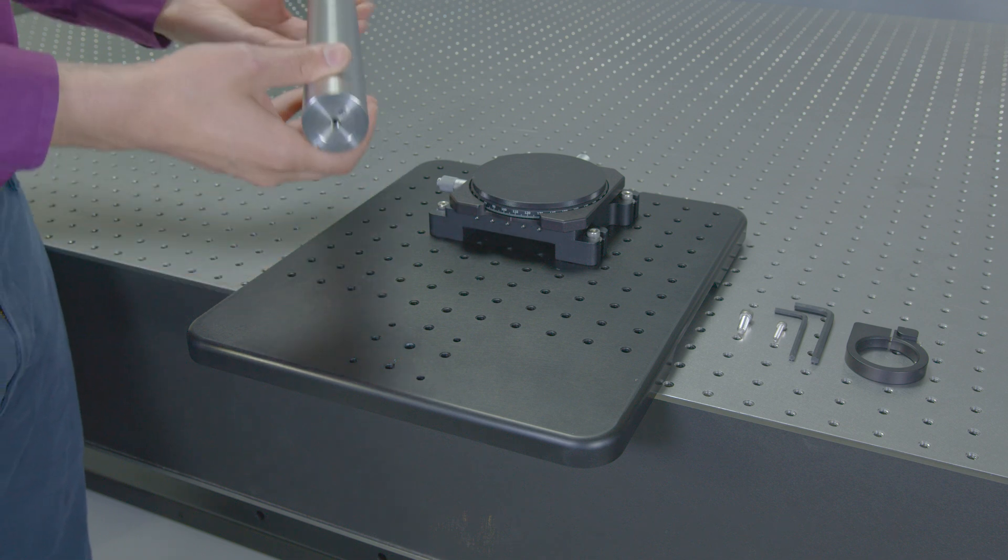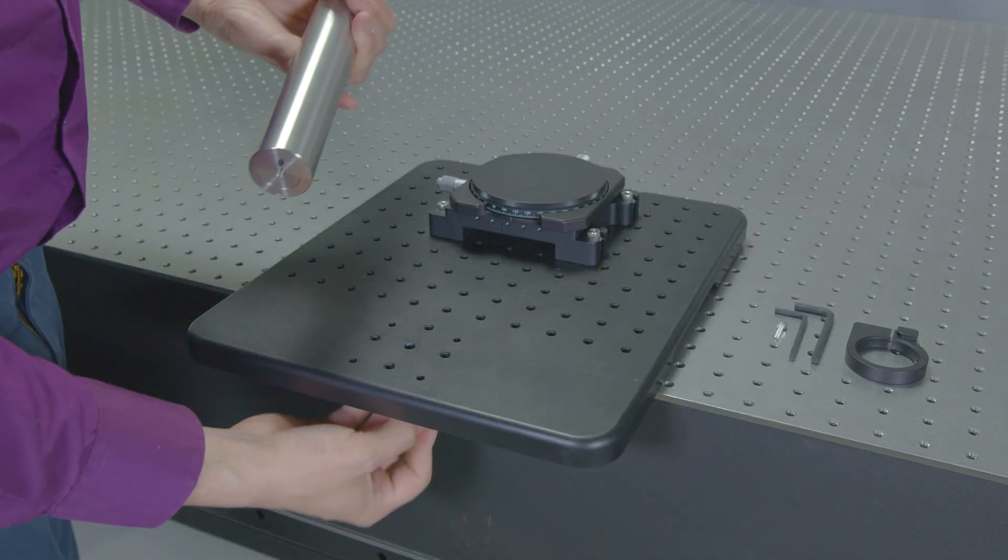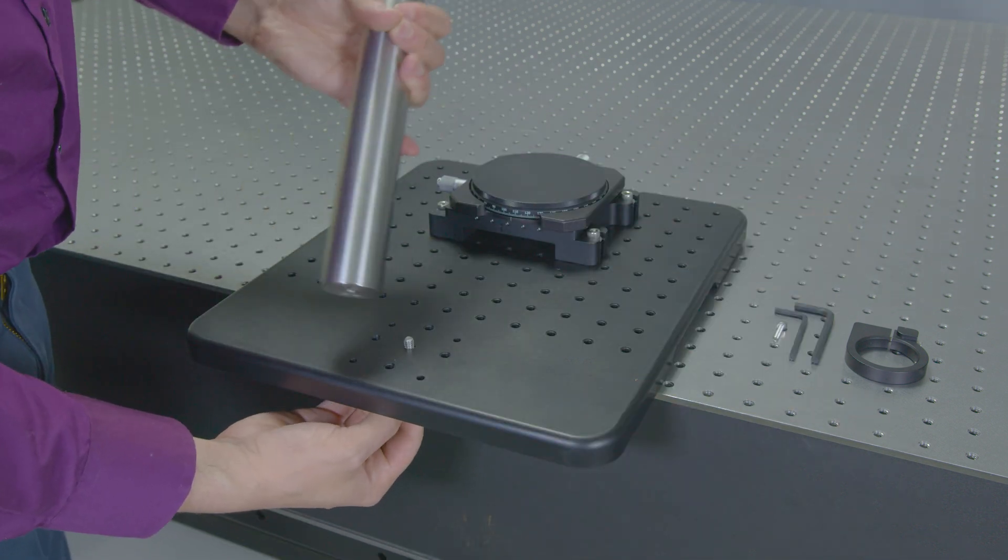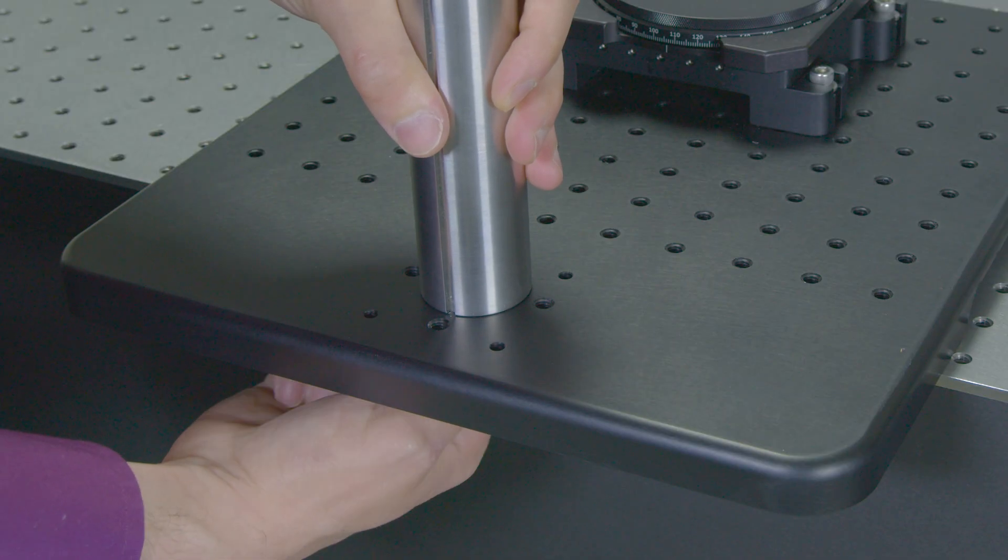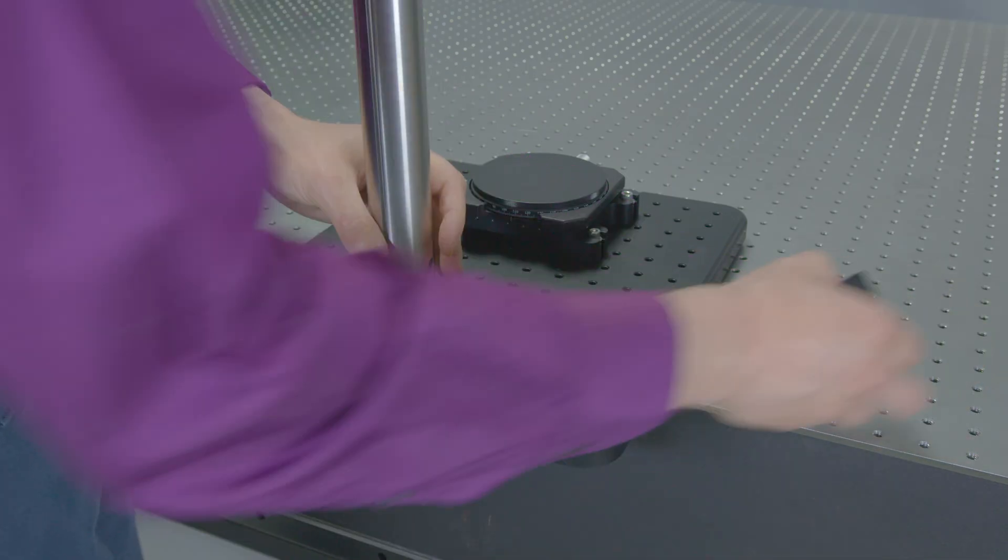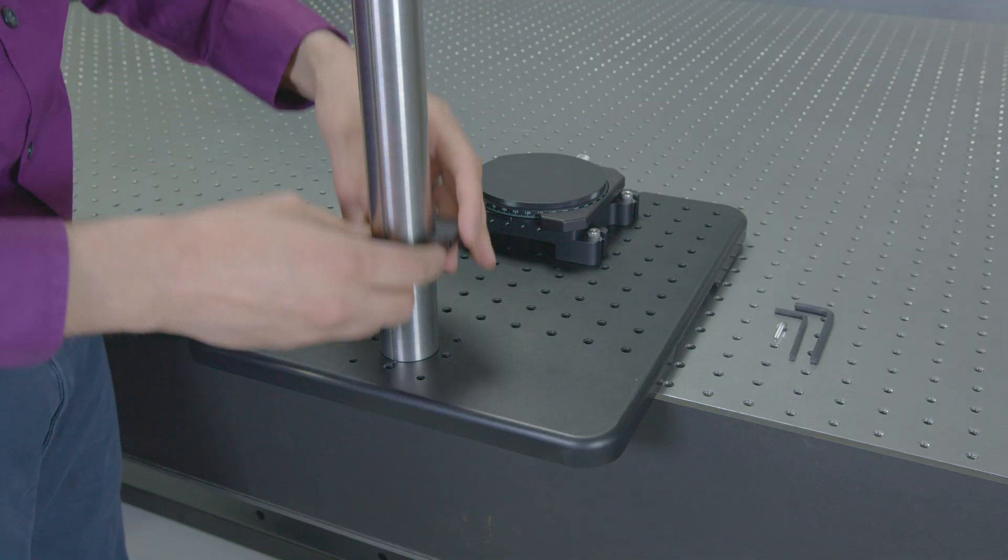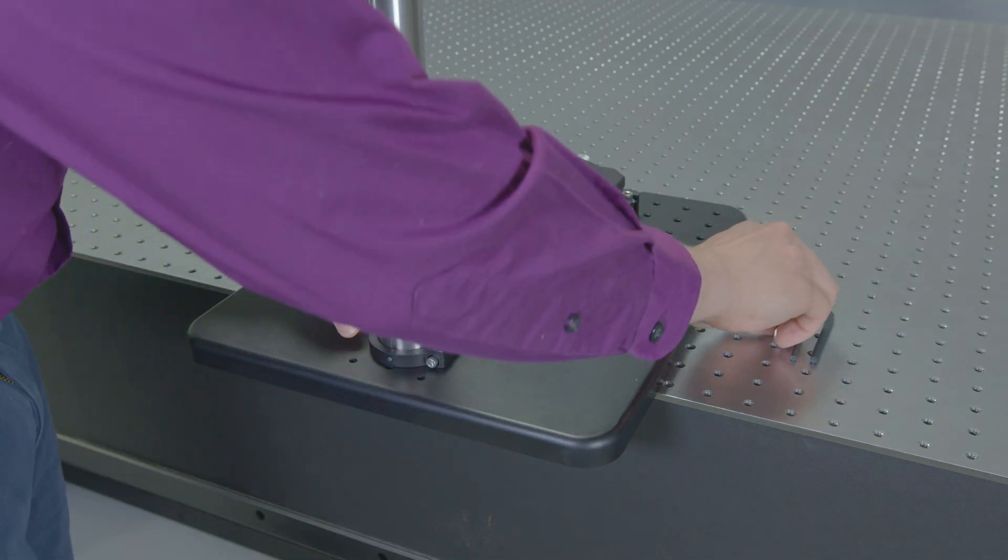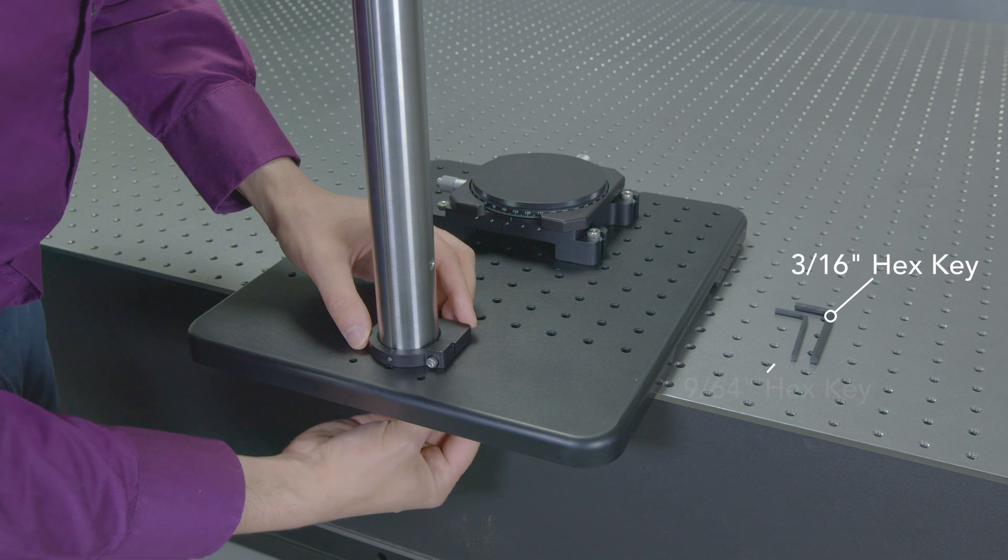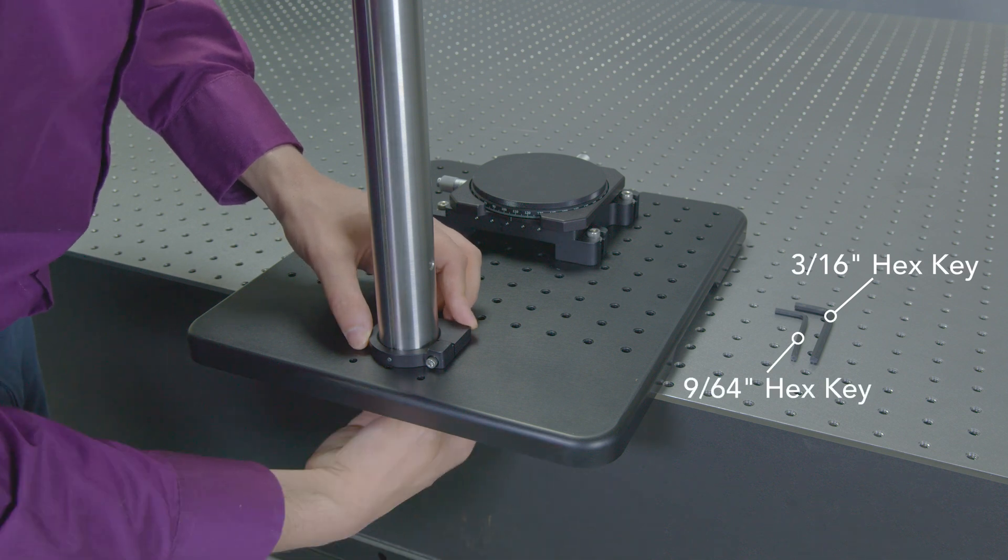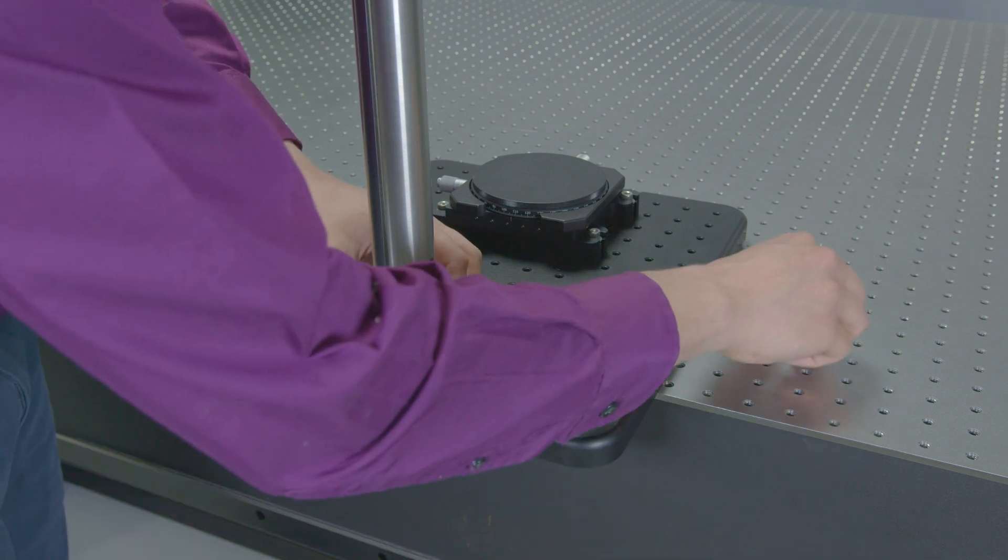Slide the breadboard slightly off the edge of your table. Thread the screw through the breadboard and into the bottom of the optical post. Place the adjustable ring onto the optical post with the alignment pin at the back of the post. Then thread a second screw through the bottom of the base into the ring. Use the included hex keys to tighten each screw.